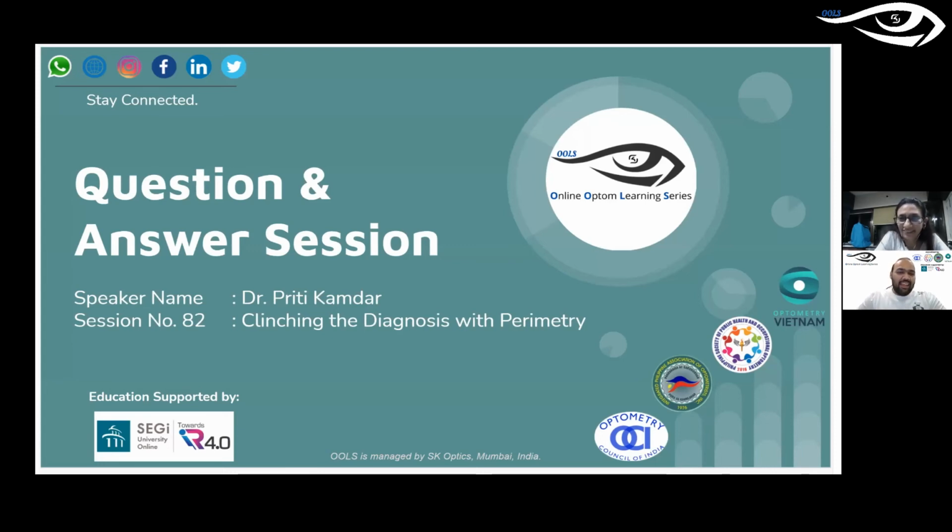The other thing I would like to get your opinion on is that most of us working in our own practice, or in an optical store, would not have access to perform a visual field test. We can definitely refer patients for a visual field test, but what's your take on performing a gross visual field examination, like confrontation, so that when you compare your field with the patient's field, you can at least know what's going wrong? Because the cases you discussed have obvious field defects which you could get on confrontation.